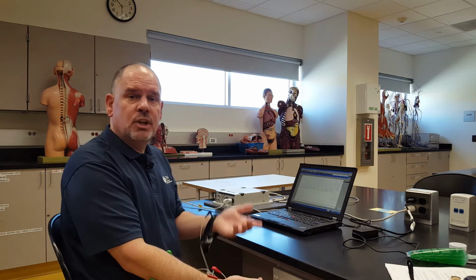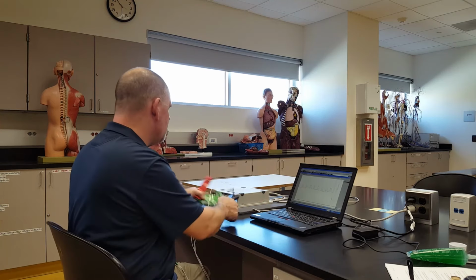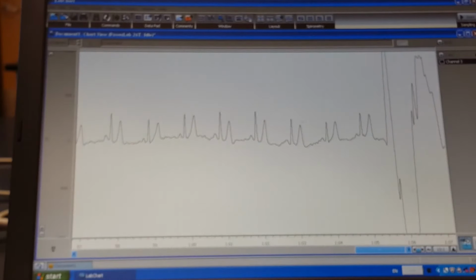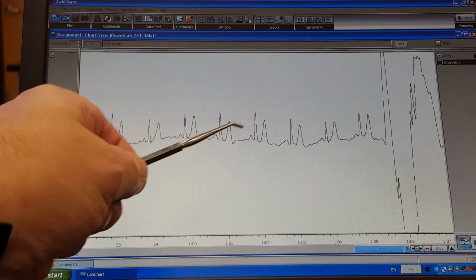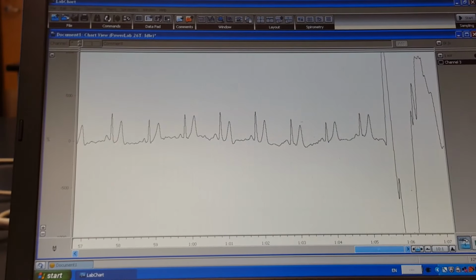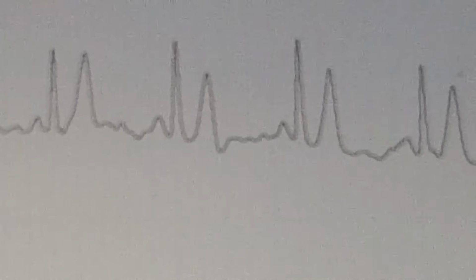Okay, that's perfectly good. Now let me reposition the camera and ungel myself so you can see what this thing actually looks like. Okay, everyone, what we have in front of you right here is a fairly standard and not bad electrocardiogram or ECG trace. So you can see the waveforms running right here, and this is just the one I recorded a moment ago. So let me zoom in a little more on just a couple of these waveforms.